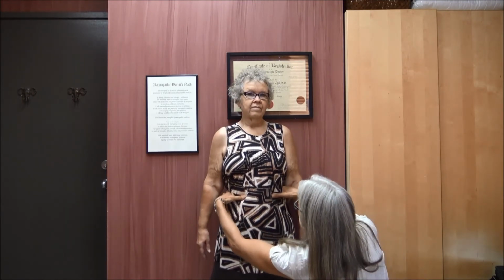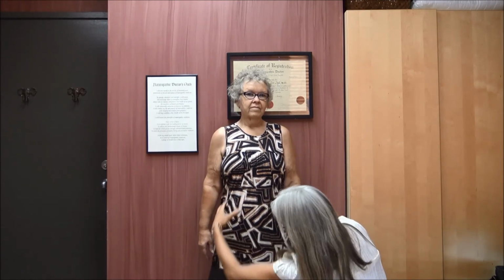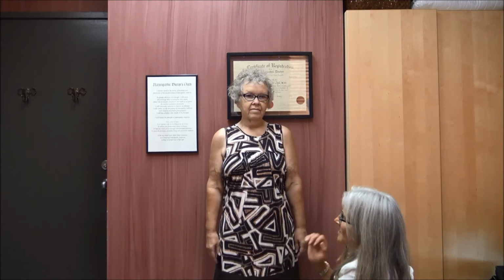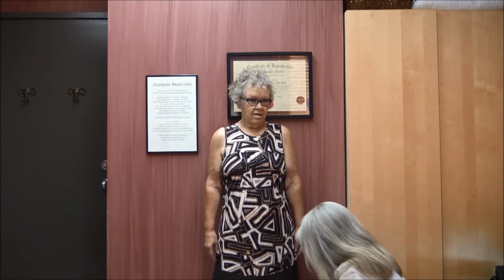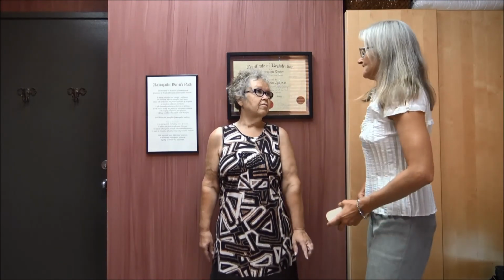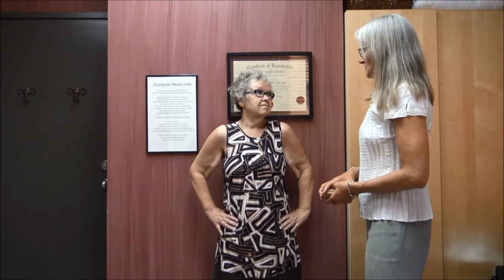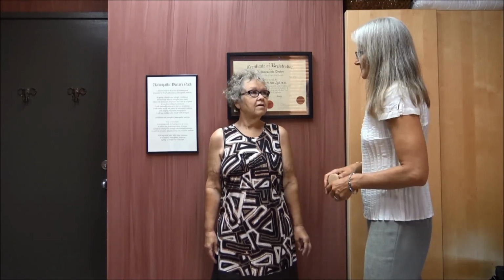And you'll actually see now that she's even. So when I pull it out, I don't know if you'll be able to see that, how her body shifted to the right. So describe what you felt with that, Paulette. I felt less pull on my left knee with having the lift in, and I felt more stable, less unstable on my feet. Yeah. So you felt like there was more pressure. More pressure. Yeah. More level.